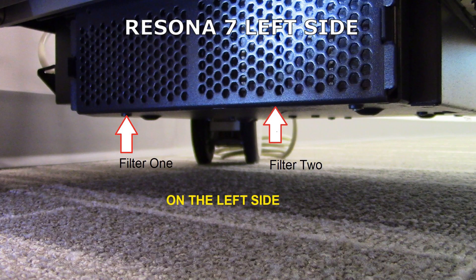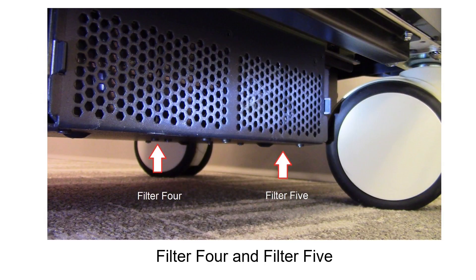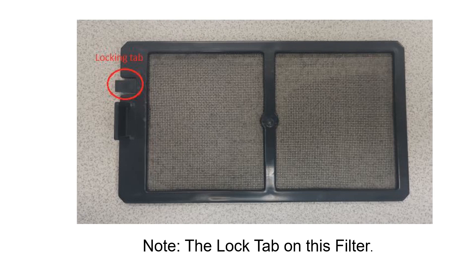Filters 1 and 2 are on the left side, filter 3 is in the front, and filters 4 and 5 are on the right side. Note the locking tab on this filter.